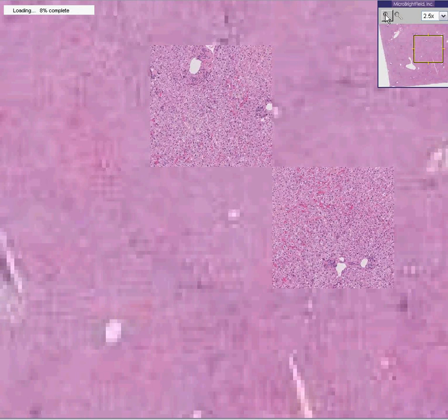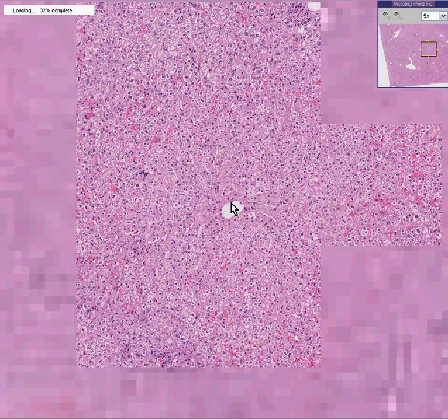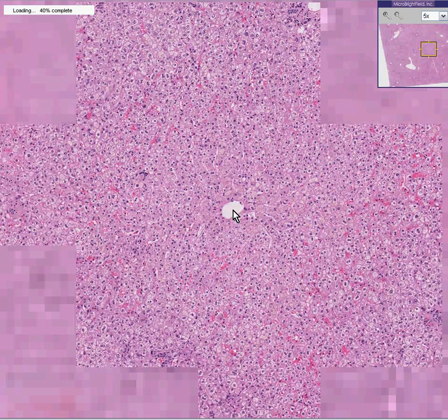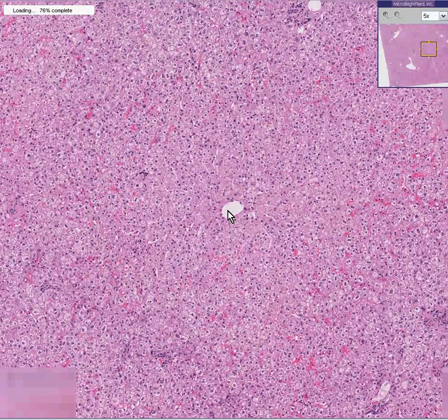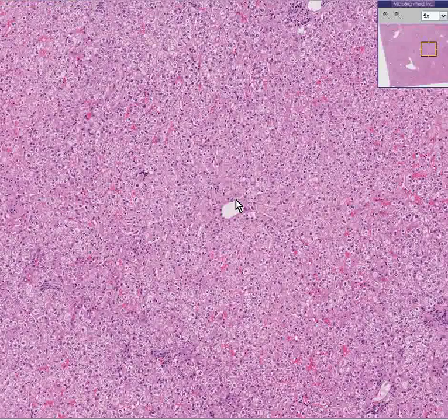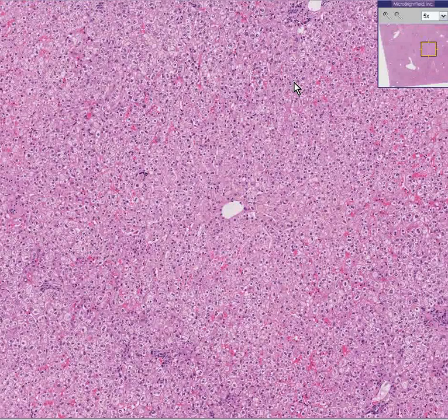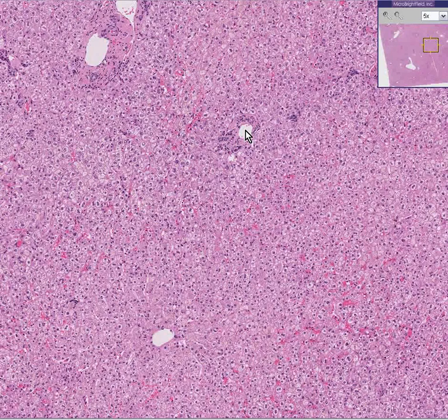Another thing you can rely on is that if you see a vein and there's absolutely no connective tissue around it, you don't have to wonder whether that's a portal vein or a central vein. Because all portal veins are in portal areas, and all portal areas have connective tissue around them. And all portal areas, besides having a portal vein, will have a hepatic artery and a bile duct.